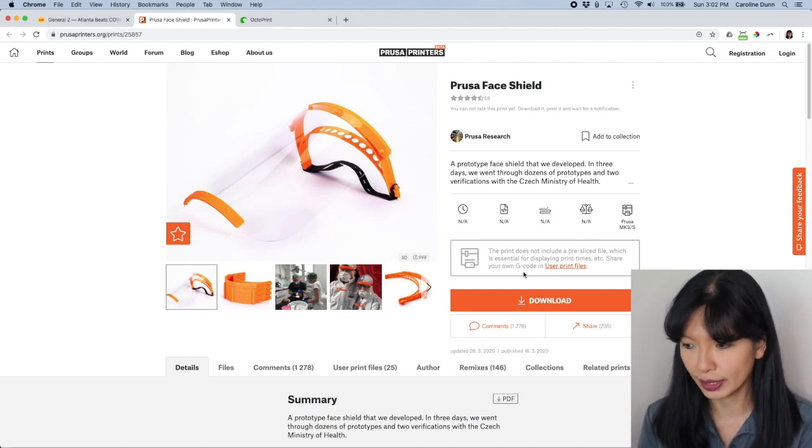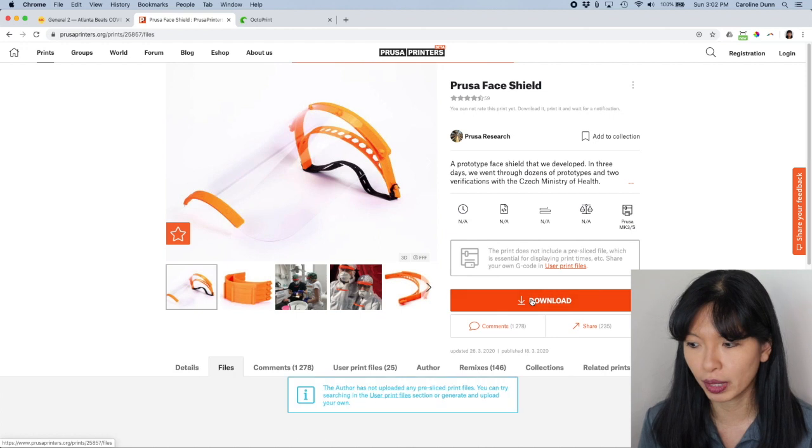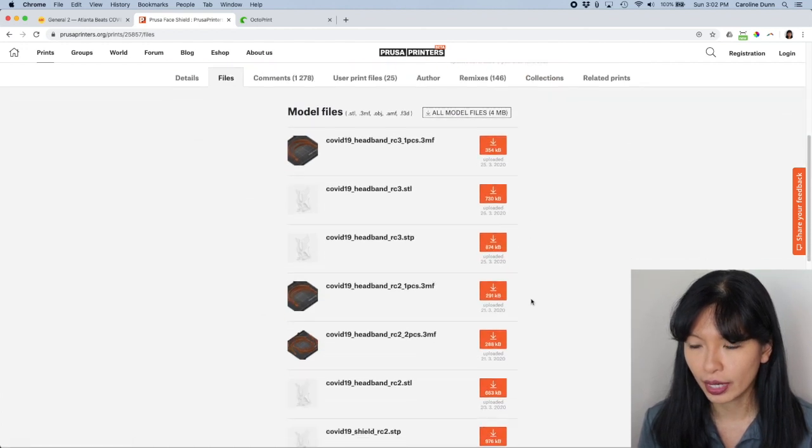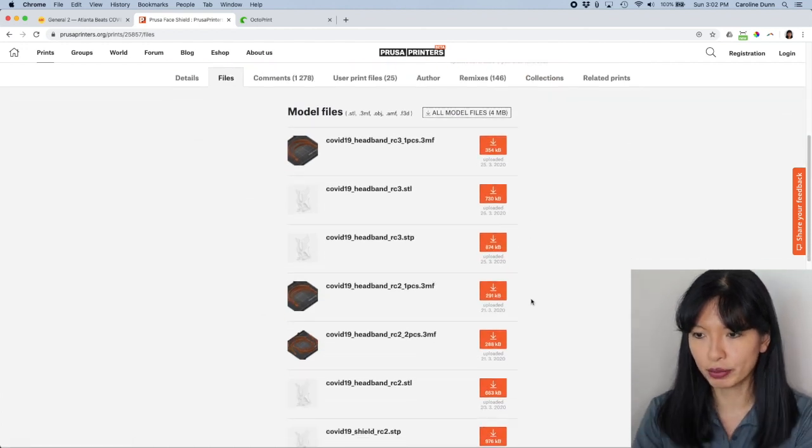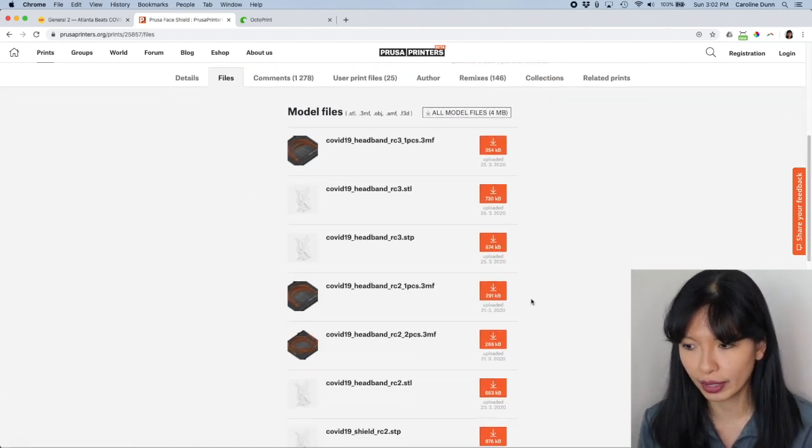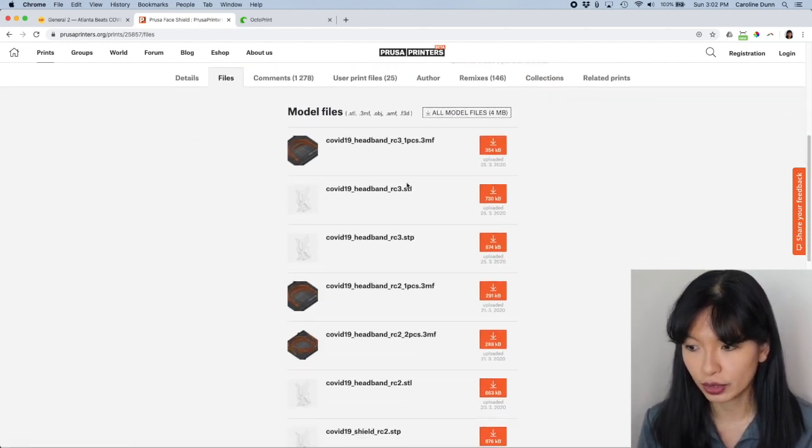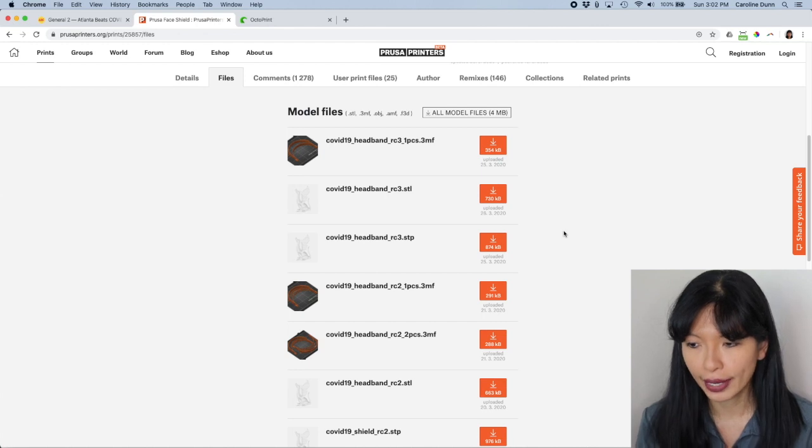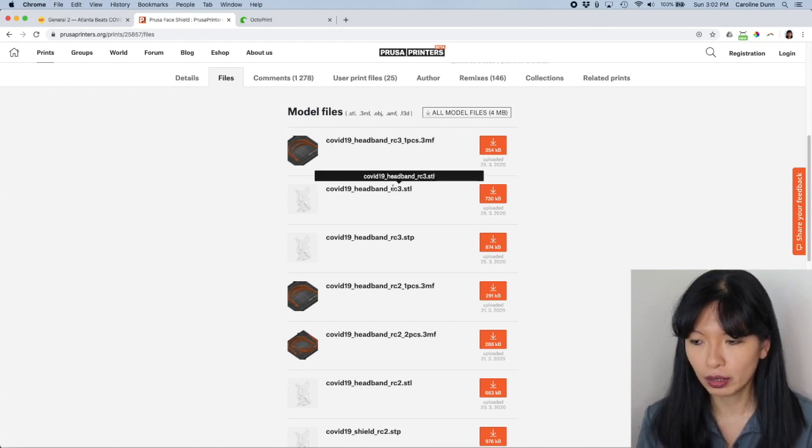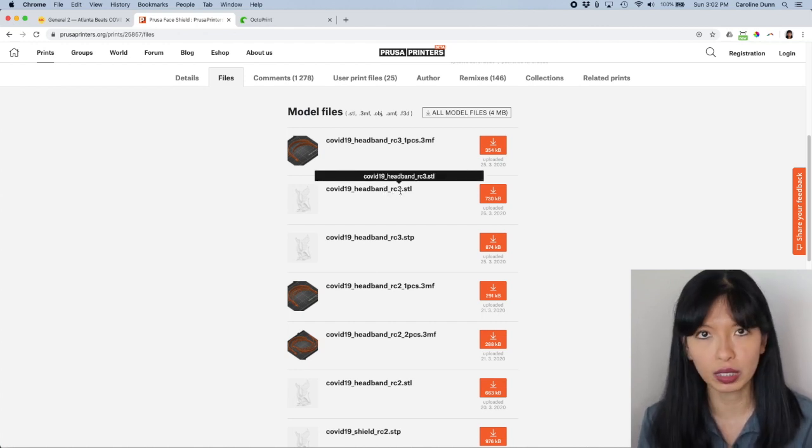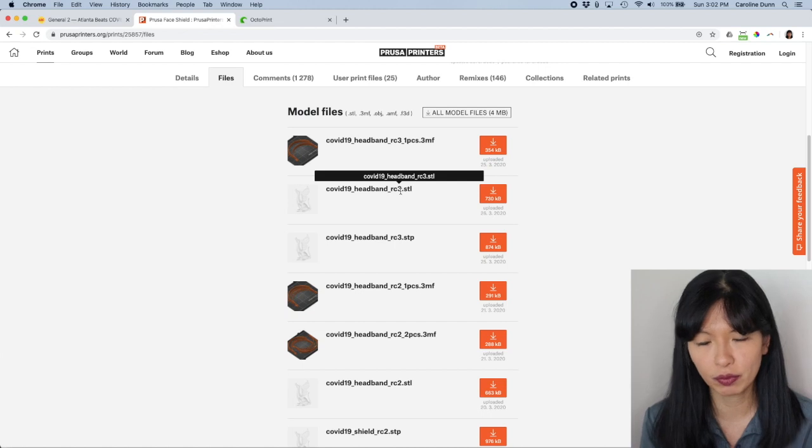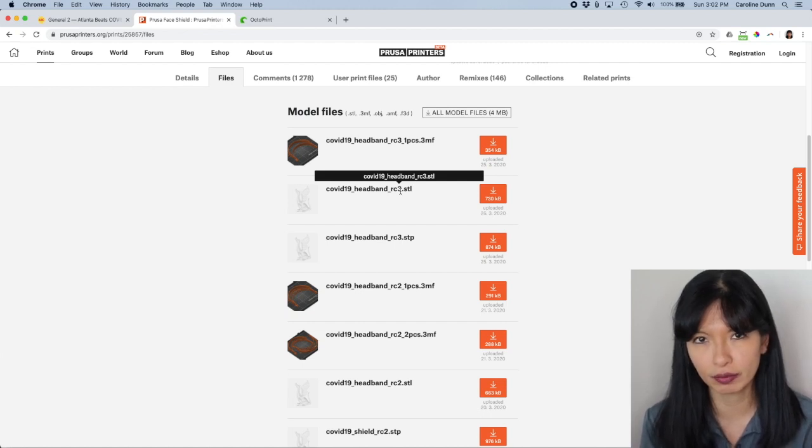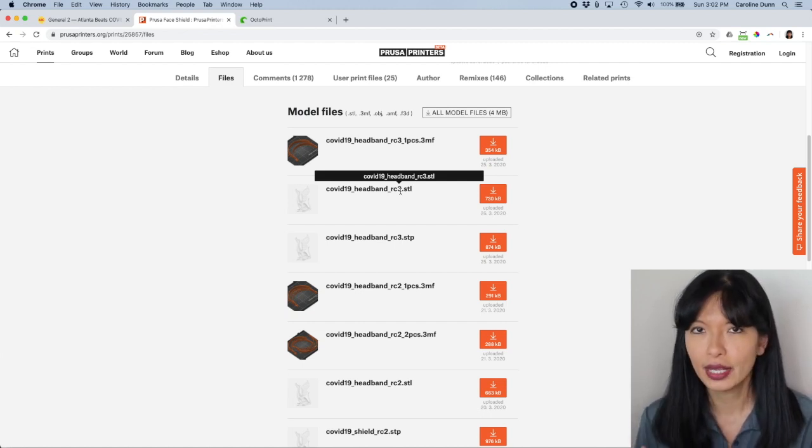Now, I'm going to hit the download button and then it just drops you down into the files and you can select from the files here. You want to look for RC3 or the latest version. As I mentioned before, they are going through several different iterations of the design based on feedback from the hospitals.